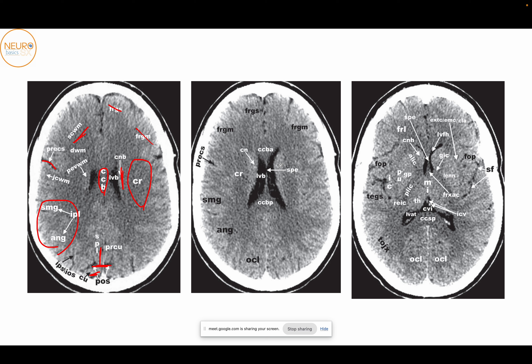Here you can see the parietal occipital sulcus, in front of which you have the precuneus and behind which you have the cuneus. As we go slightly lower, you can start seeing the lateral ventricle a lot more clearly. The lateral ventricles on both sides are separated by the septum pellucidum. In some cases, the septum pellucidum will be separated into two leaflets — that is called a cavum septum pellucidum, a very normal anatomical variant. The only concern is during surgery when you can get stuck between the leaflets while thinking you are inside the ventricle.